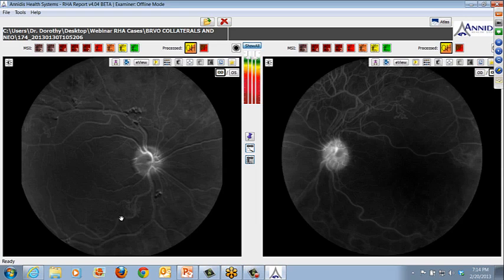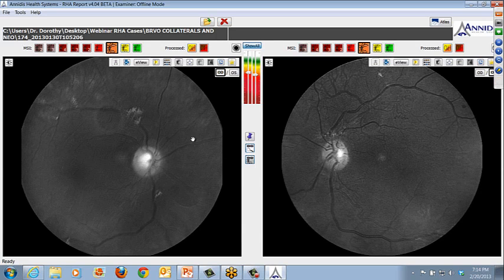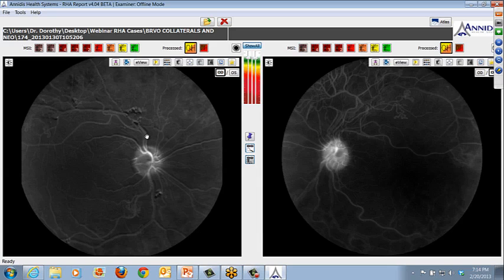I wanted to show you an example of how this is not a reliable view because the oxy map is a combination of the yellow and the amber, and the technician should have retaken the image here in the amber. This should have been clearer, and if they did that, then your oxy map would be reliable here. It is not reliable in this format. You can see the difference between those two image sets here.